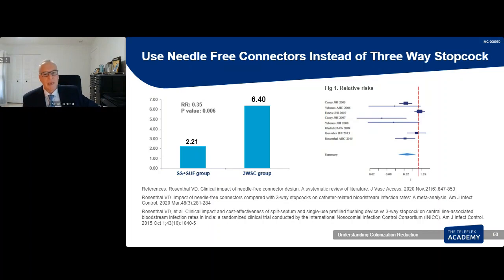disconnect and then clamp. It's the opposite for negative displacement. Instead of disconnect and clamp, you need to clamp and then disconnect because of the moment of the reflux. Another important point we will discuss later in the next slide, which is scrubbing the hub.